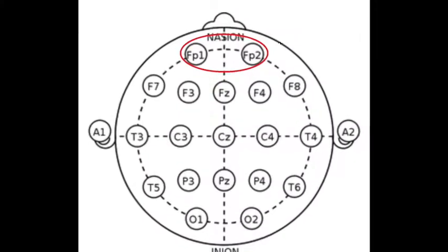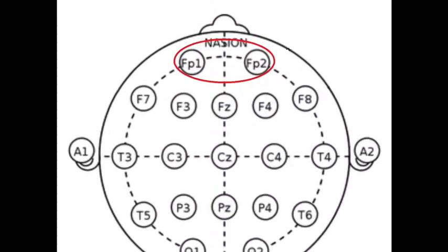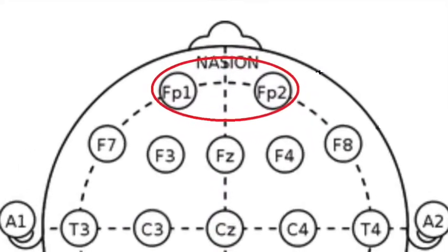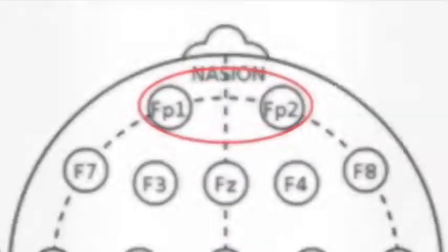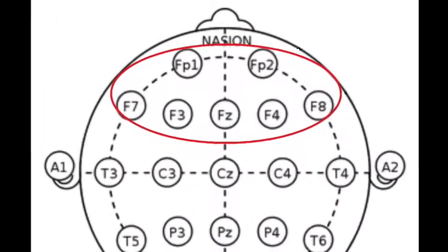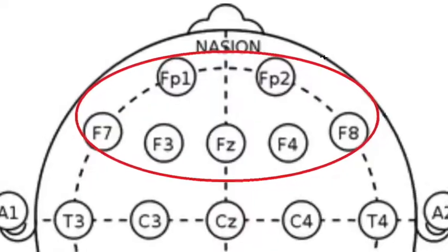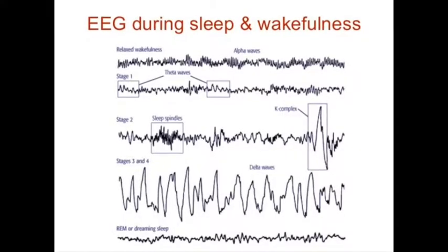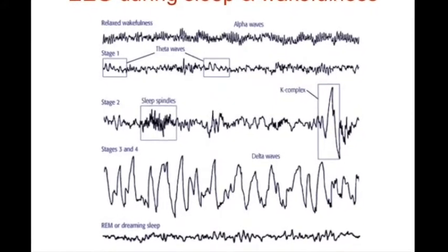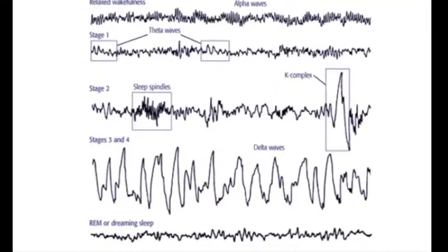Electrodes are placed at FP1 and FP2 to measure the alpha rhythm from the frontal lobe. The alpha rhythm from the frontal lobe signal that is measured in FP1 and FP2 is then used to control music. F3, F7, F8, F4, FP1, and FP2 electrodes are placed to measure the delta rhythm during sleep. Usually delta rhythm occurs during stage 3 and stage 4 of sleep in adults. The delta rhythm signals become dominant in the frontal lobe, therefore measurements of multiple areas of the frontal lobe is optimal.